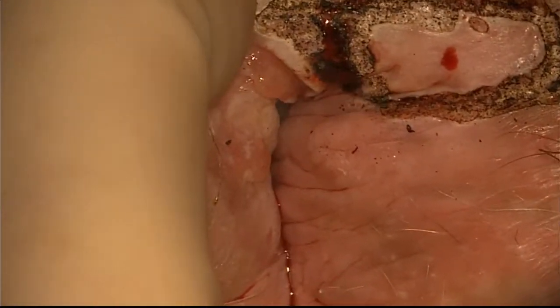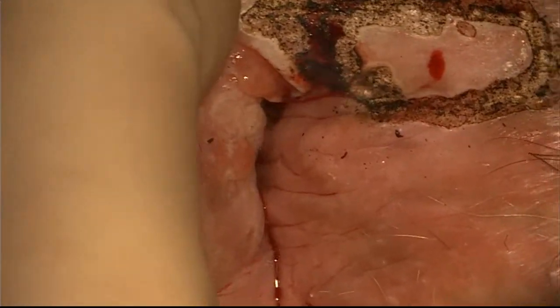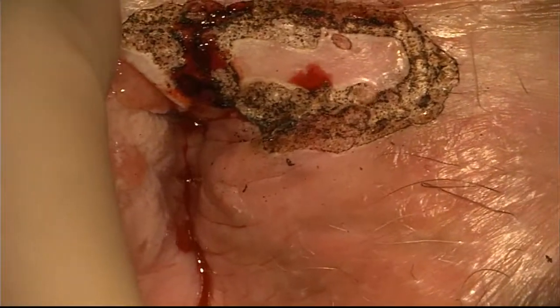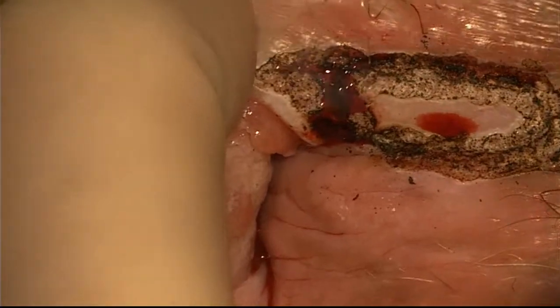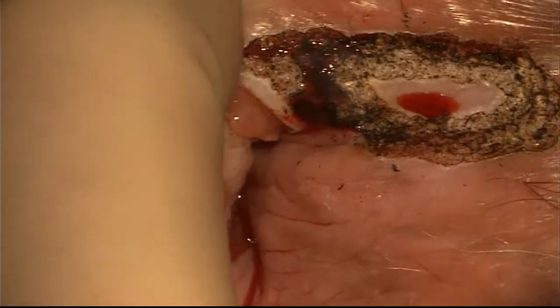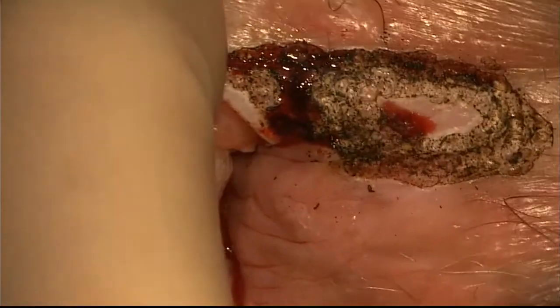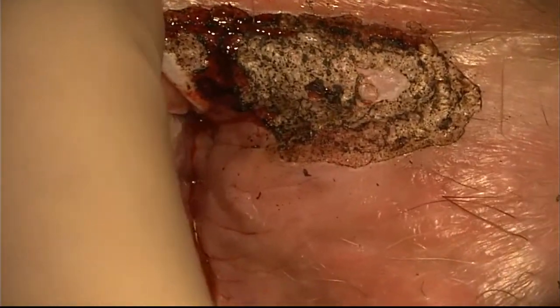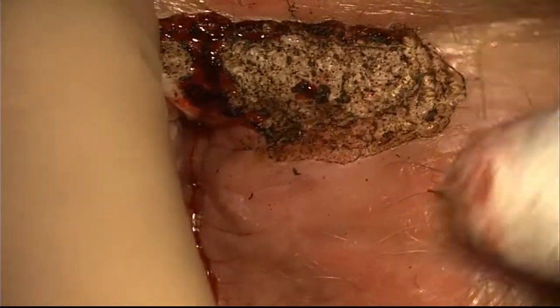After outlining the lesion, I am now using my hand to move the patient's perianal tissue instead of moving the toggle on the laser head. This allows you to use both hands to expose the tissue.